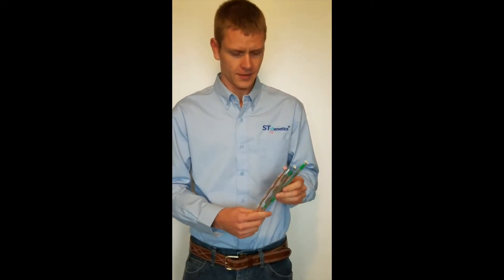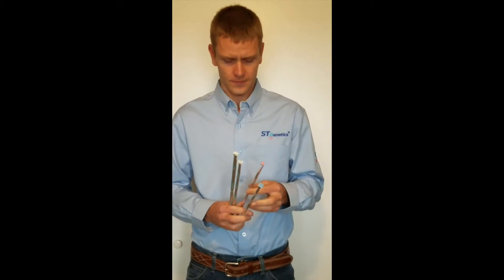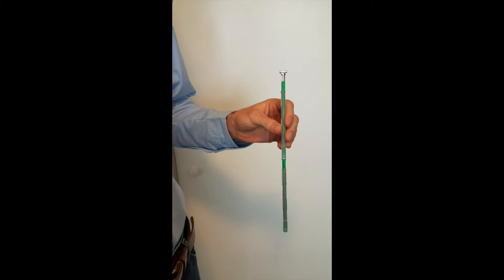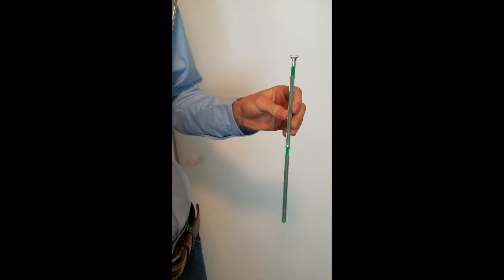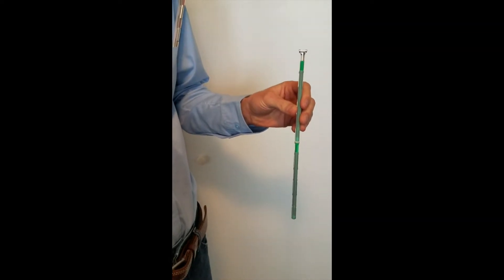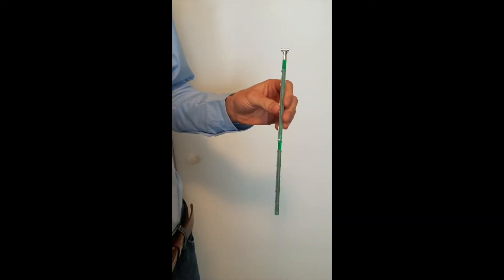I also have here conventional quarter cc straws, and also sexed male in the blue and sexed female in the pink. Here we have the quarter cc conventional straws — you can see they're packaged in a green straw. This is to help keep some of the UV rays out, but you'll always want to keep them out of the sun to avoid damaging some of those sperm cells.